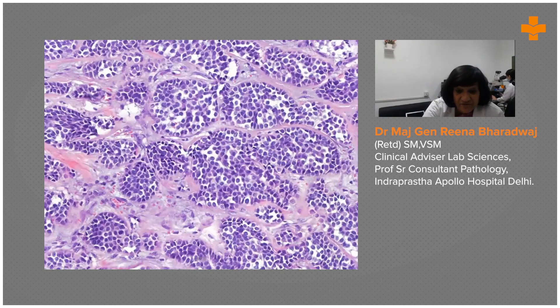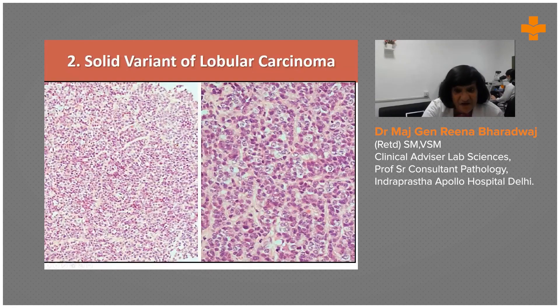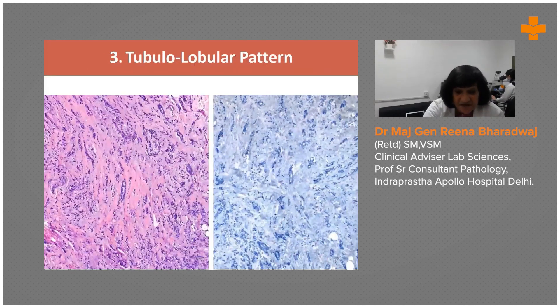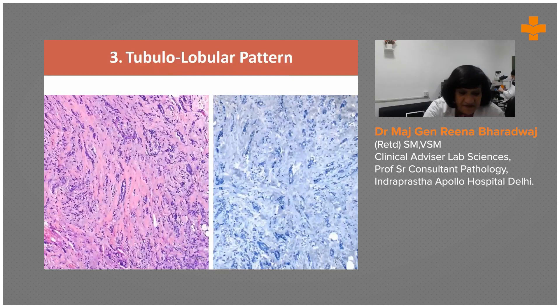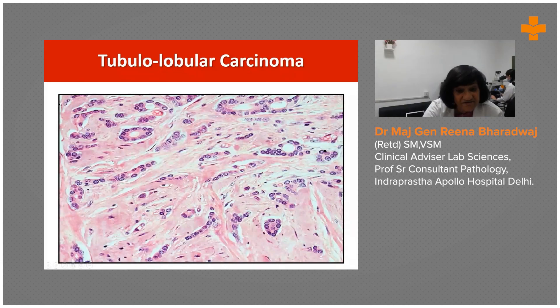At higher power, the cytoplasm of the alveolar variant is more abundant and the cells are not as monomorphic. There is also a solid variant of lobular carcinoma with meek-looking cells in discohesive sheets, so tightly packed that the vacuoles must be specifically sought. It can be associated with tubular carcinomas — called tubular-lobular — where you see the angulated beaks of tubular carcinoma alongside the Indian file of invasive lobular, creating a mixed tubular-lobular variant.